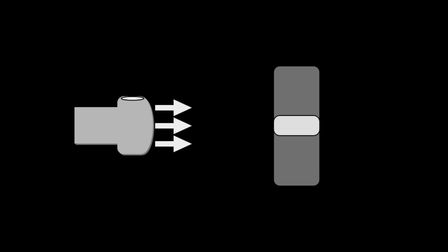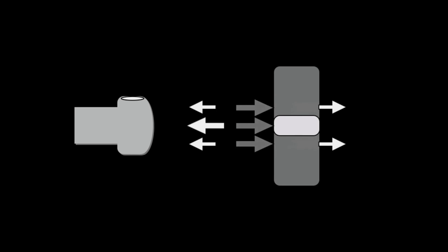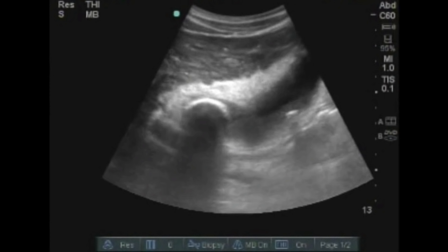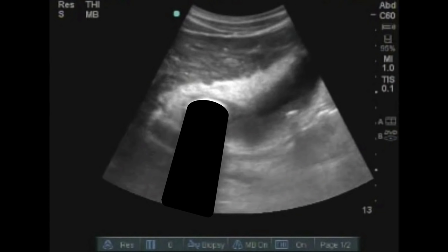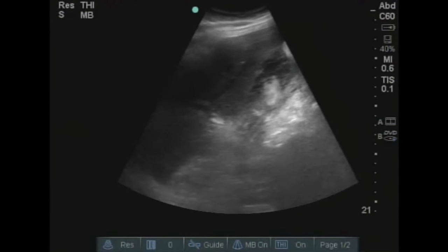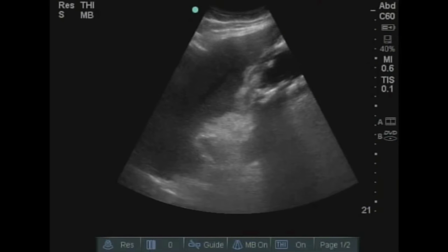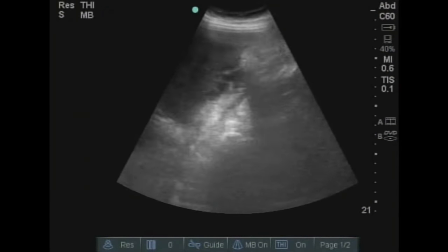Shadowing artifact is produced when there is a high difference in acoustic impedance. The high attenuation causes sound to be reflected back to the transducer, making a very bright image, but no sound is transmitted past that interface. In a gallstone, you can see the bright interface where sound is reflected — the gallstone has very high acoustic impedance compared to surrounding tissue, so sound does not penetrate further. The dark area below is acoustic shadowing, as shown when scanning a gallbladder with multiple stones.